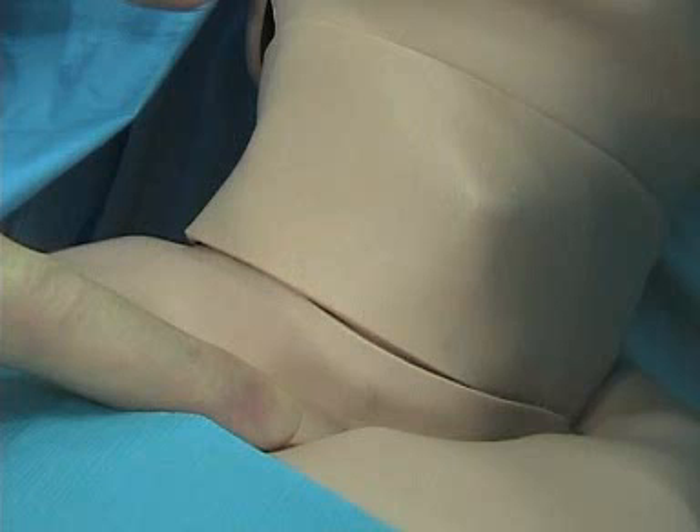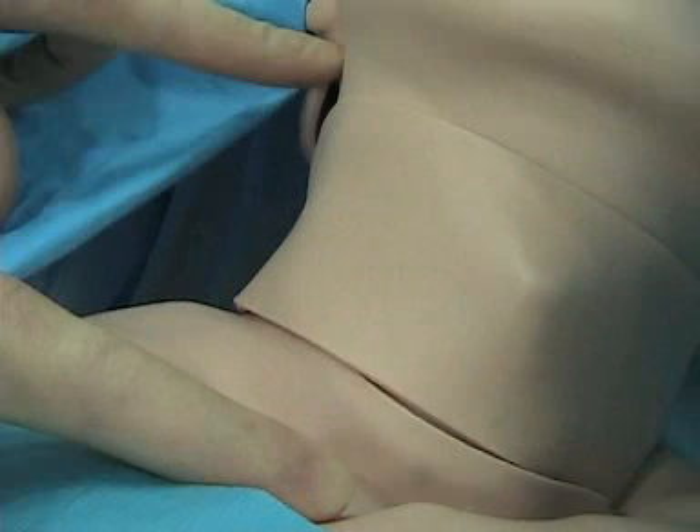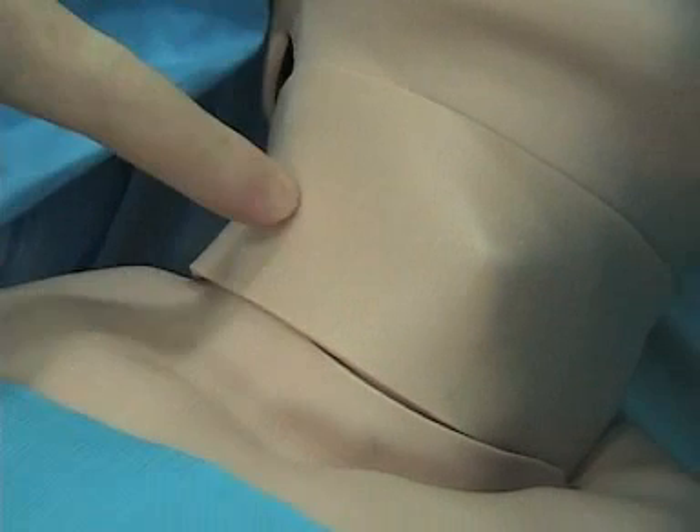We're going to talk about the bread and butter line we put in all the time, which is the right IJ central line, which can be used either for a central line or a Swan. Everybody has a sternum — feel that sternal notch, then feel the mastoid, and what's in between them? No surprise: the sternocleidomastoid. If you have nothing else to go on, go at about the halfway point and you're going to be in business.